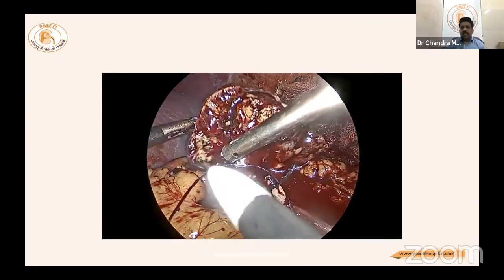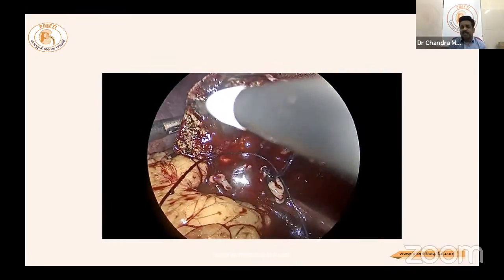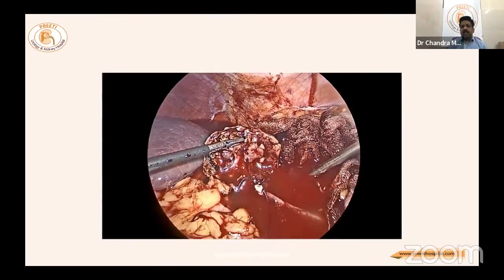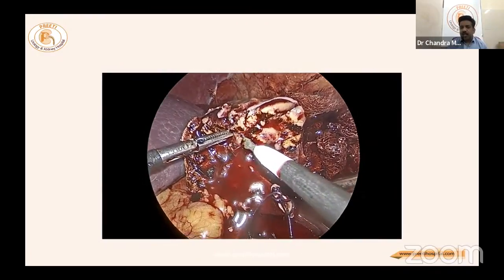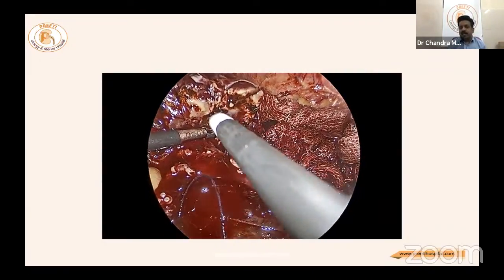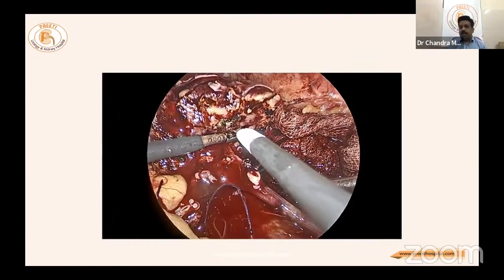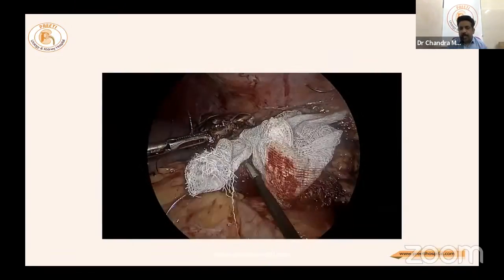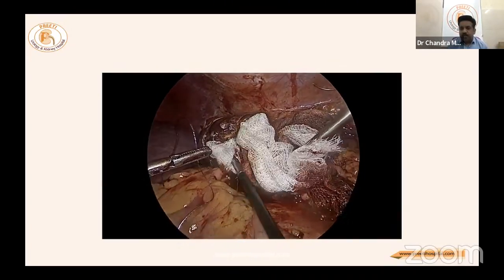Since the renal artery is open, coagulation is done; inner or outer renorrhaphy cannot be performed now. Wash, identify any small bleeders, and take stitches superficially. If deep bites are taken, deep vessels become involved and there is no point in having done hemi nephrectomy. A major drawback is that deep bites must absolutely be avoided — all bites must be very superficial. Apply plenty of gauze pieces; they help with hemostasis. Applying saline and washing also helps.